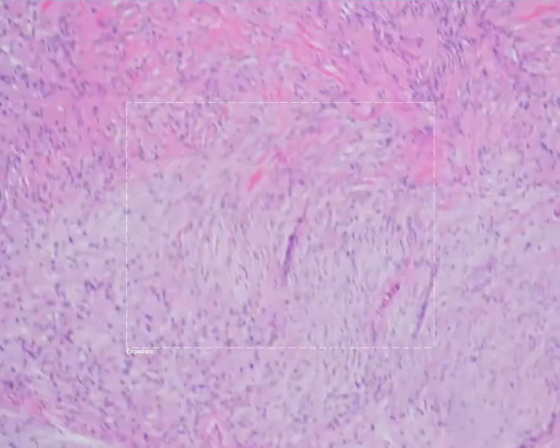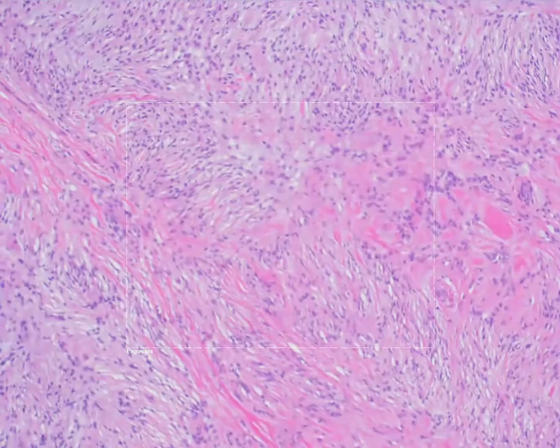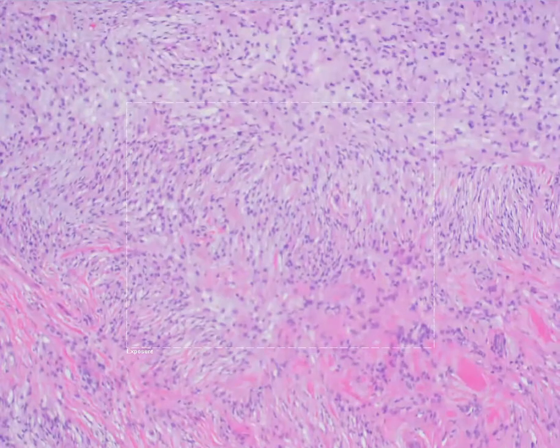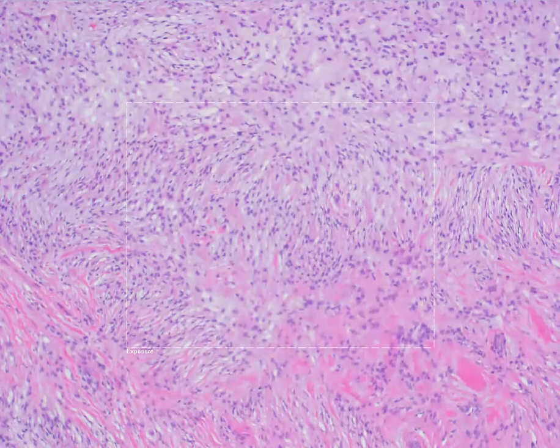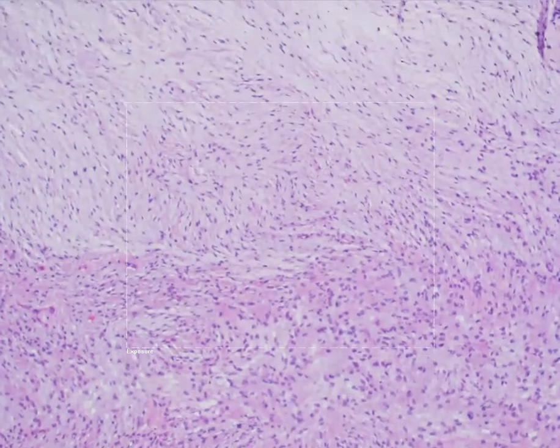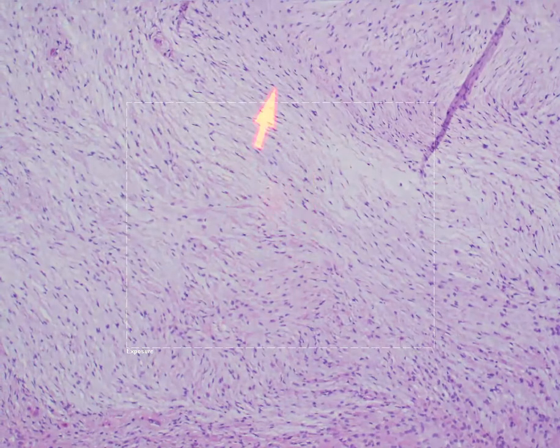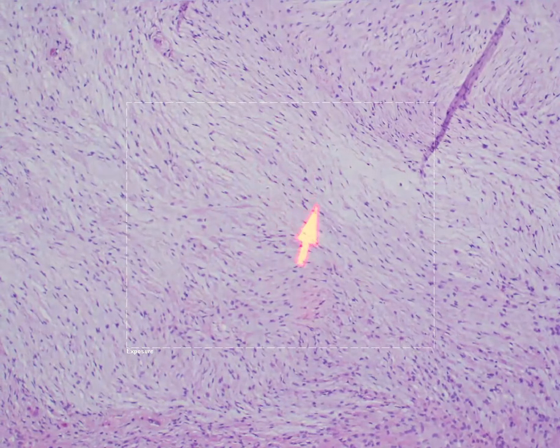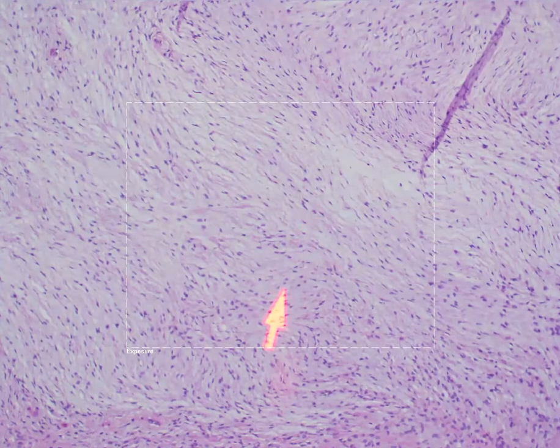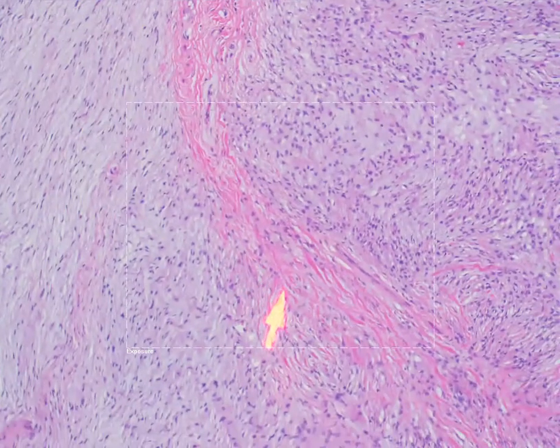Usually the cells look very bland, so you're not going to see much in the way of mitotic activity and you won't see much nuclear atypia. The stroma can vary quite a bit. In this case, most of what I've shown you, the stroma looks very loose and myxoid — meaning mucinous, it looks kind of mucinous.